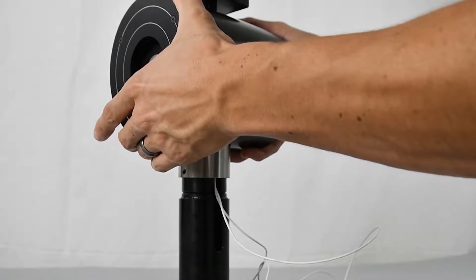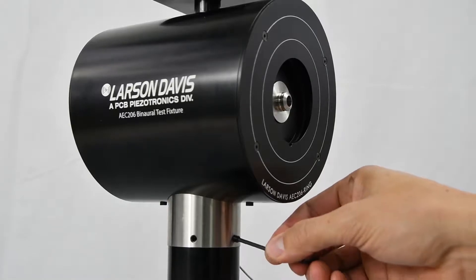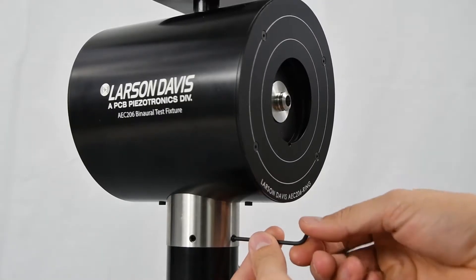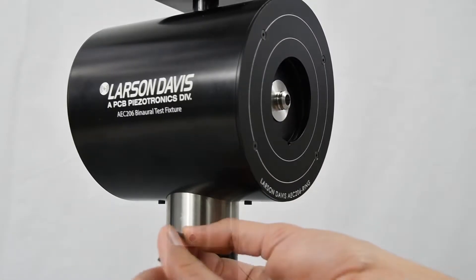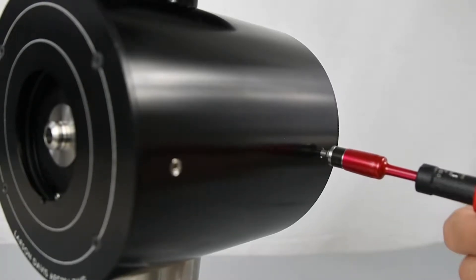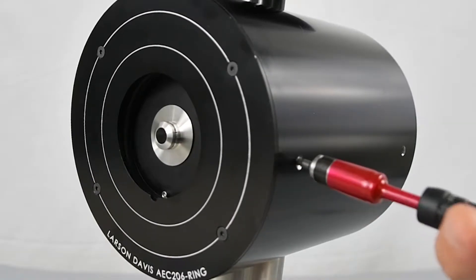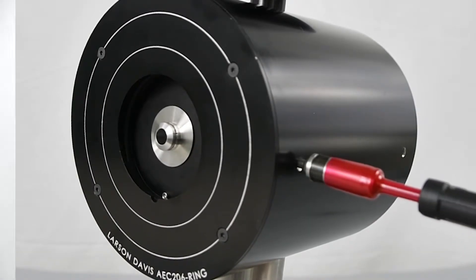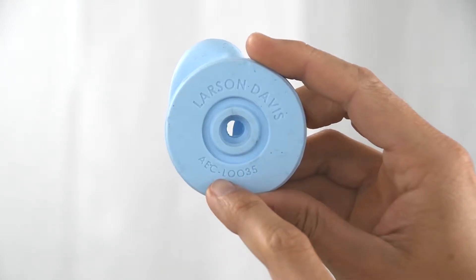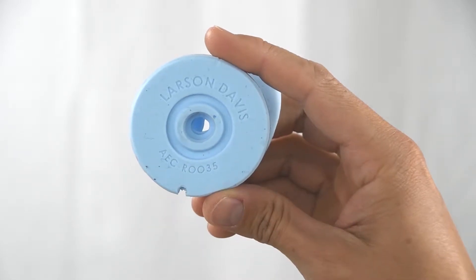If the ear simulators pop out a little, that's okay — just push them back in. Put the neck screws in and tighten. With your Torx screwdriver set to 40 oz inches, tighten the set screws. These hold the ear simulators in place. The left pinna is indicated with an L in the product name, and the right with an R in the product name.